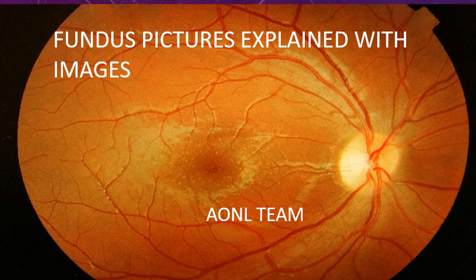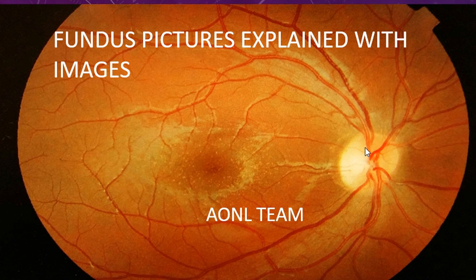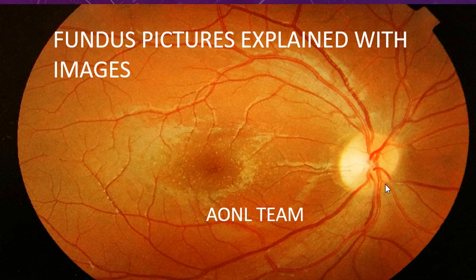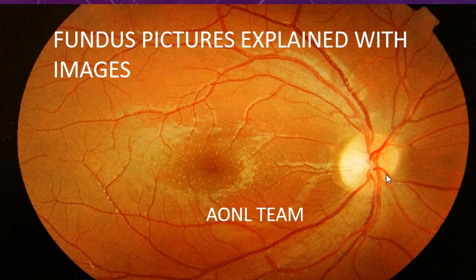Let us start with the examination of a normal fundus. This image is of a normal fundus of the right eye — you can see the macula on your left side and the disc on the right side. This is the optic disc, which represents the optic nerve head; from here the optic nerve continues to the brain. The margins of the optic disc on this image look normal. In cases of optic disc swelling or papilledema, the disc margin will be blurred.